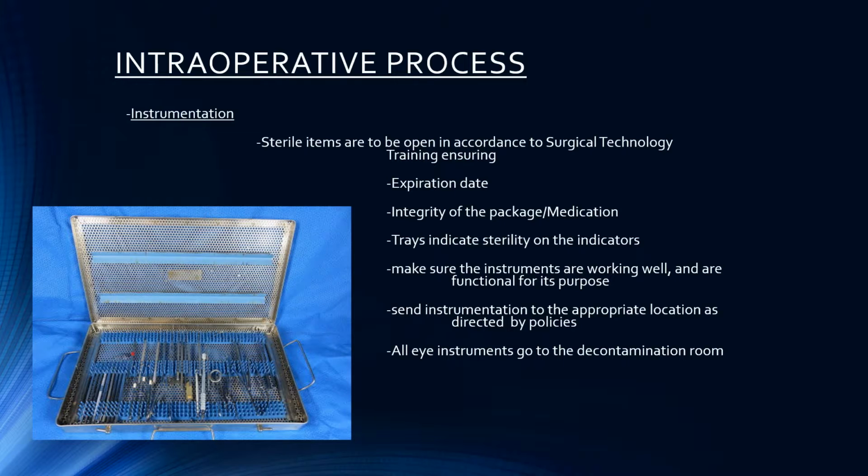And you need to send your instrumentation to the appropriate location as directed by the policies when you're all done. And all eye instruments usually go to the decontamination room. The reason why they all go to the decontamination room is because they're so fine. They're so small. They can get damaged so easily.